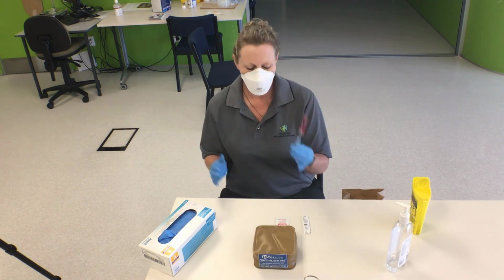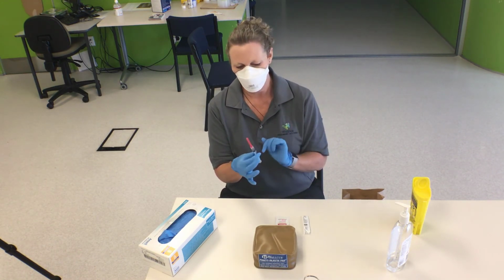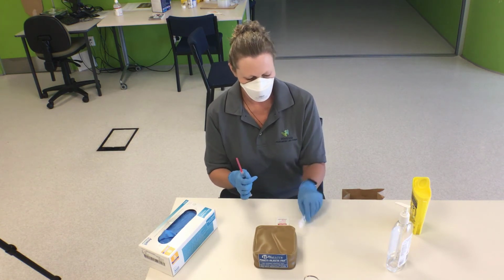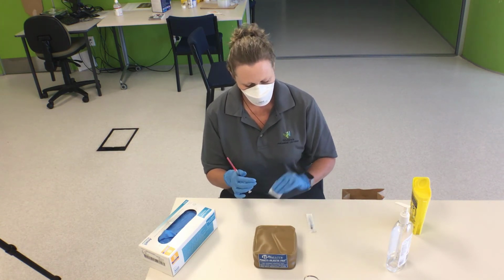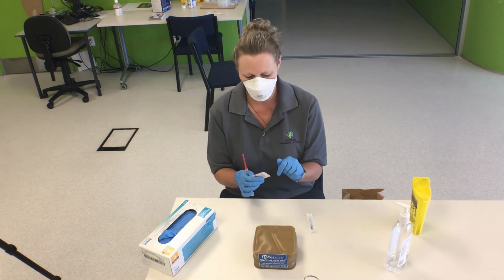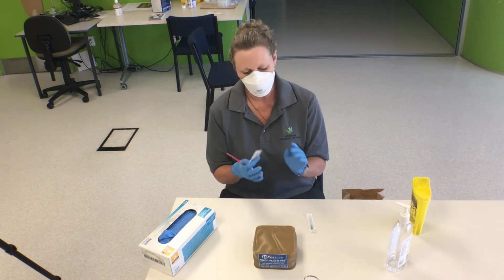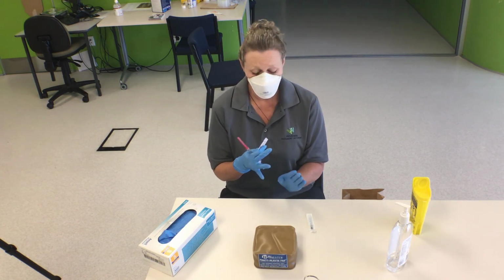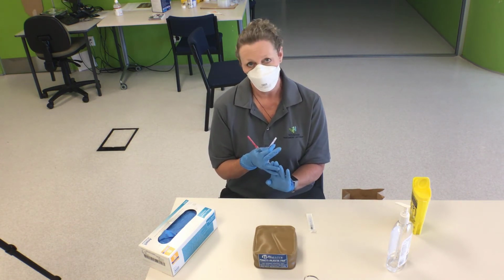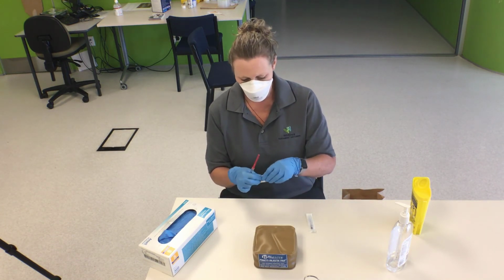Normally we wouldn't recap a sharp, but a blunt's very hard to take off if you don't have the cap on it. So while I'm getting ready, I will be swabbing this patient's area. We wouldn't normally swab IM or subcut unless the patient was actually physically dirty or immunocompromised, and because this is an end of life care guideline, we will do that swab.